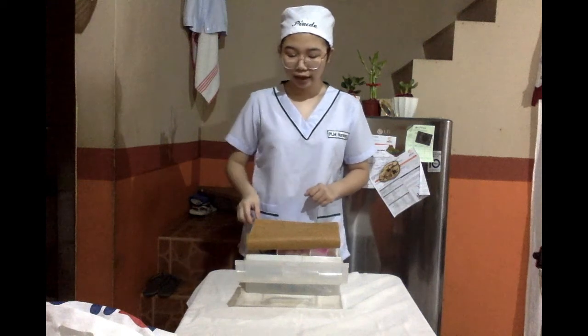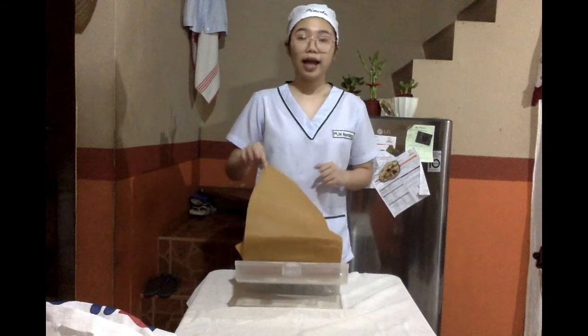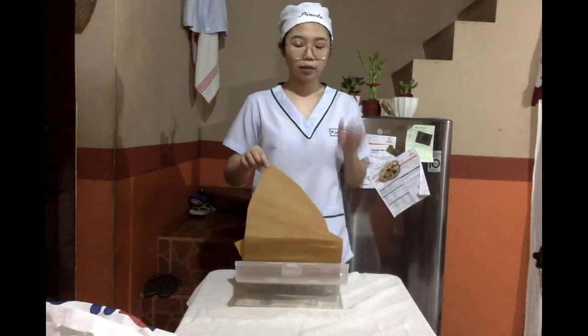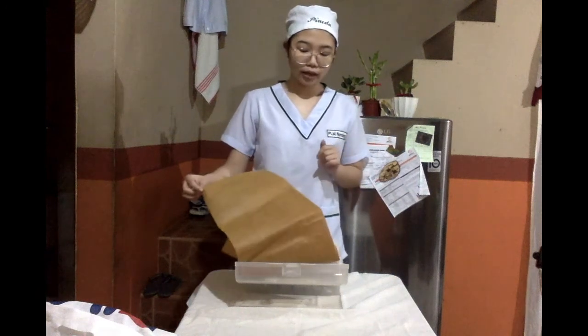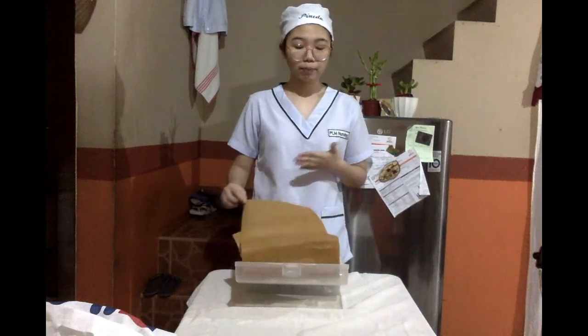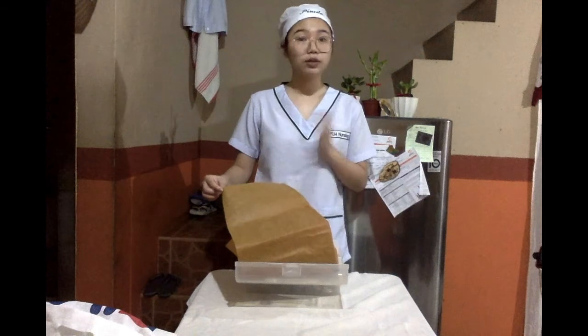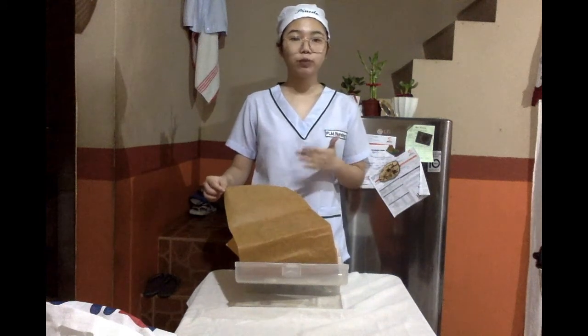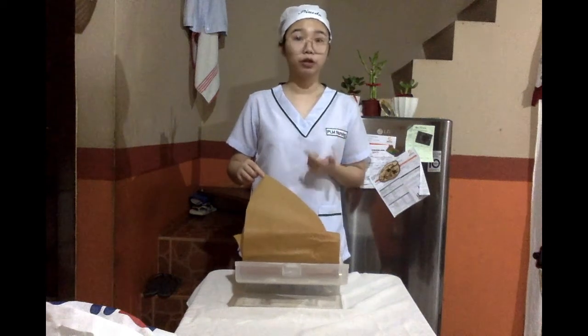Then I will now take off this drape from the catheterization kit and place it under the buttocks of the patient. So this provides a sterile field. The procedure is just the same with the previous clips that I've shown. However, instead of rolling to sides, the client will just raise her hips and we will place this drape under her buttocks. Then I will don sterile gloves to avoid contaminating other items in this kit.